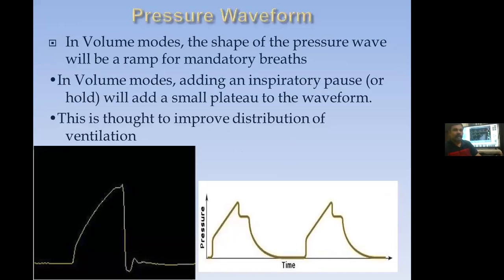And the pressure waveforms. In volume modes, the shape of the pressure wave will be a ramp for mandatory breaths, and in volume modes, adding an inspiratory pause or hold will add a small plateau in the waveform. This is thought to improve the distribution of the ventilation.